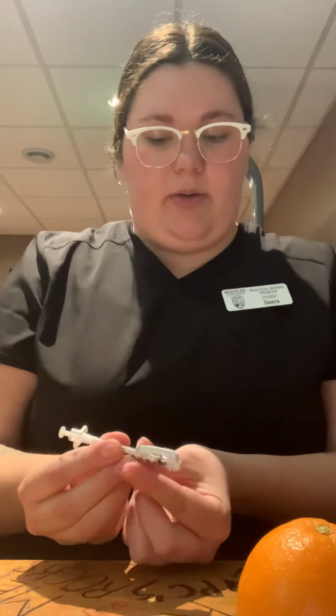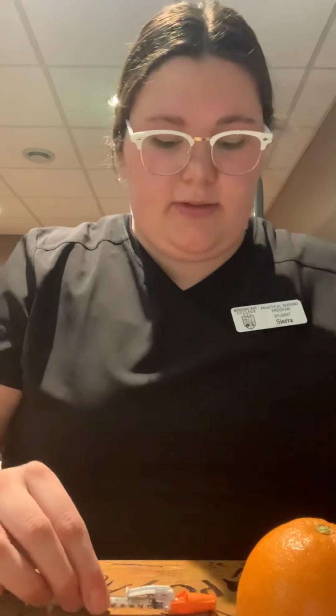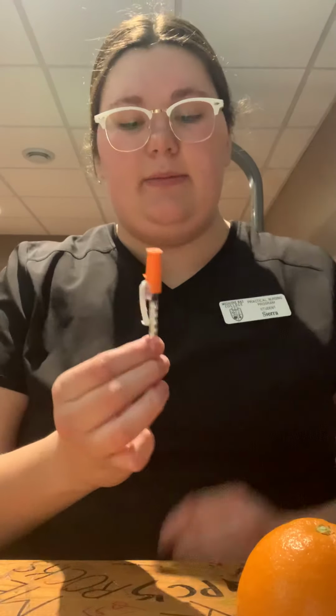So this out. And then now we're going to, again, scoop our lid back on so we're not getting any needle stick. Put the lid on, and then we're going to dispose of this into the sharps. So now I would document on the MAR, on the bit paper, and then come back and check on the patient in 30 minutes for reassessing.